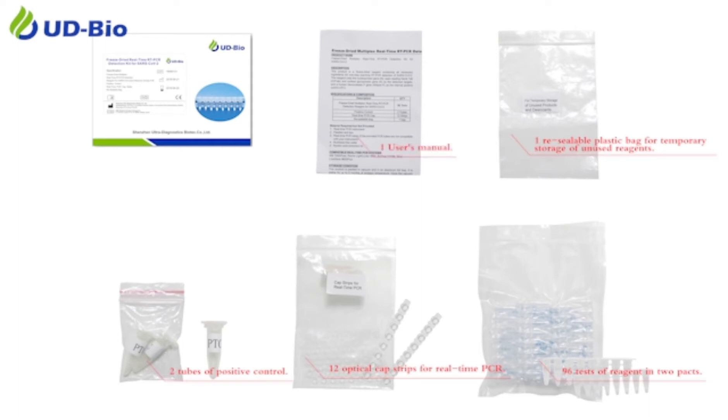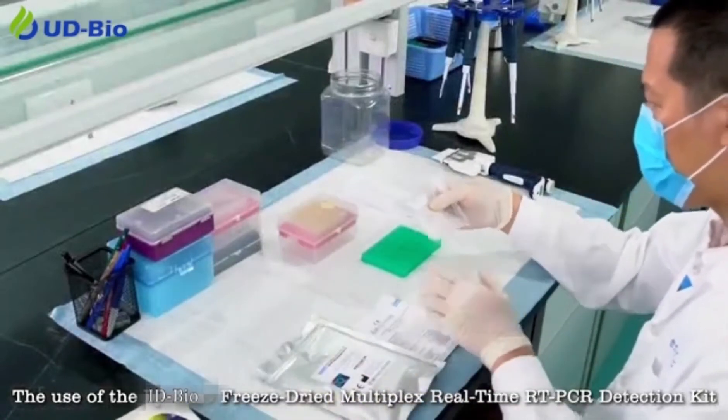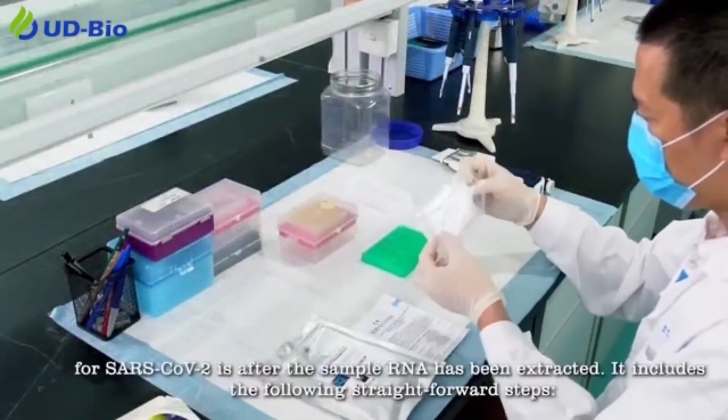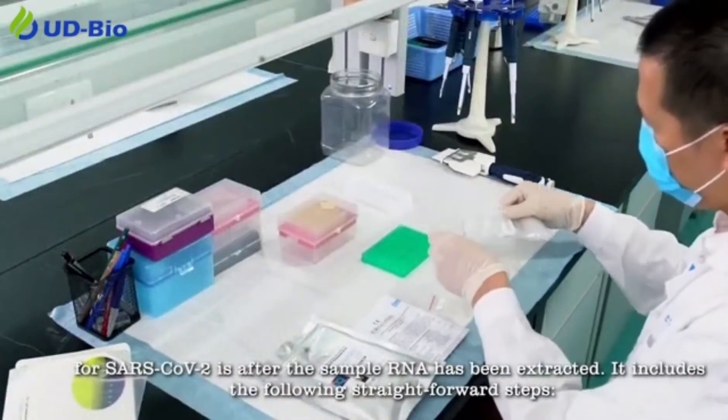The use of the Freeze-Dried Multiplex Real-Time RT-PCR Detection Kit for SARS-CoV-2 begins after the sample RNA has been extracted. It includes the following straightforward steps.